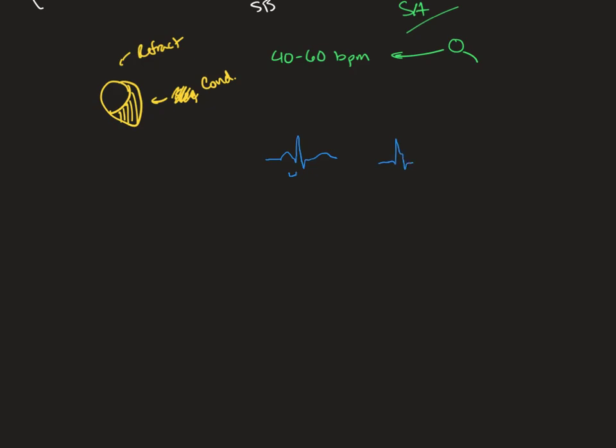where the P wave, the atrial, or you could have our inverted P wave, our retrograde P wave.